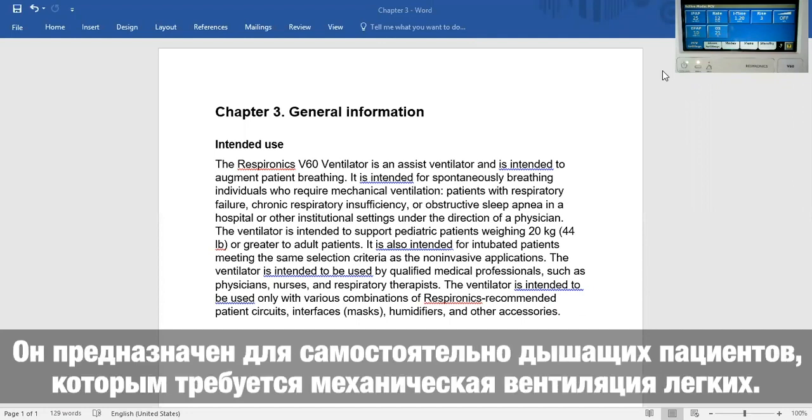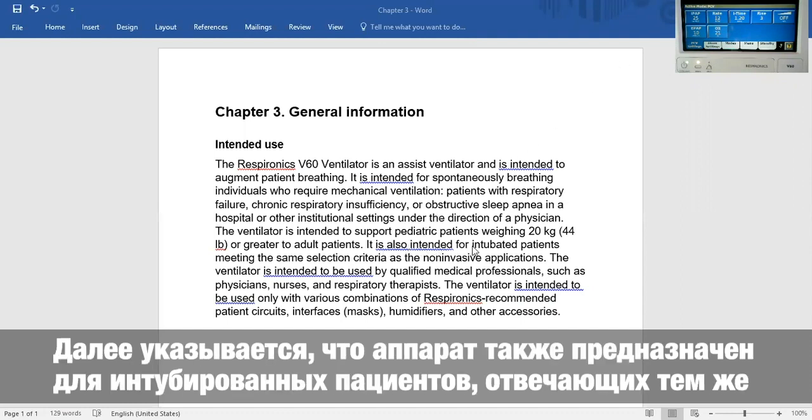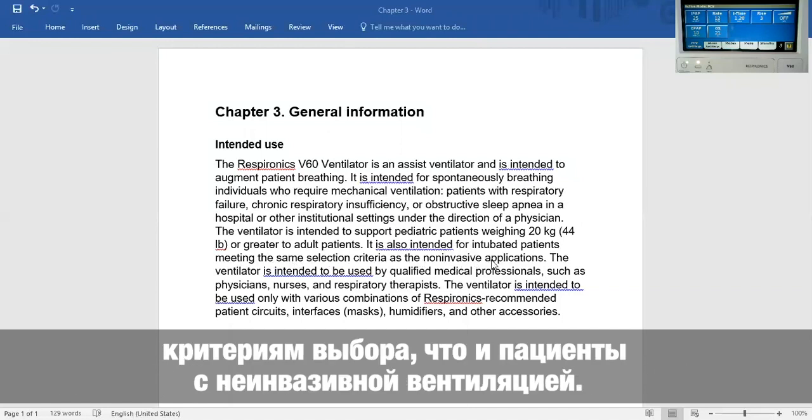It is intended for spontaneously breathing individuals who require mechanical ventilation. It is also intended for intubated patients meeting the same selection criteria as the non-invasive application.